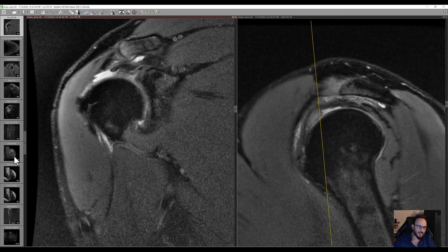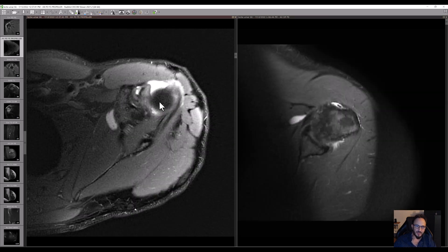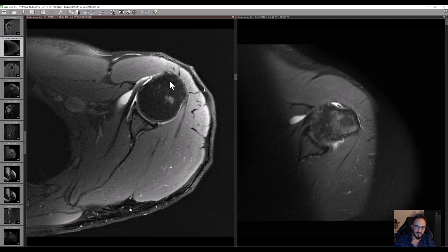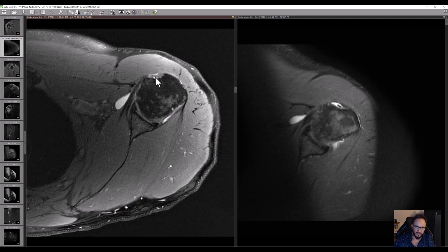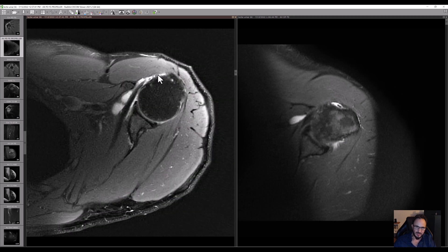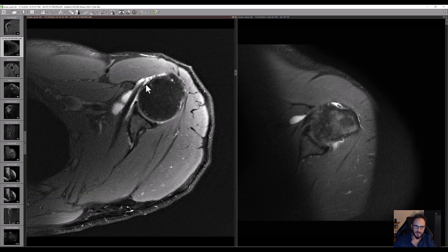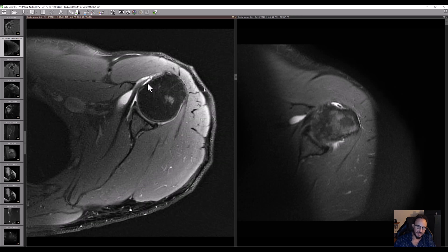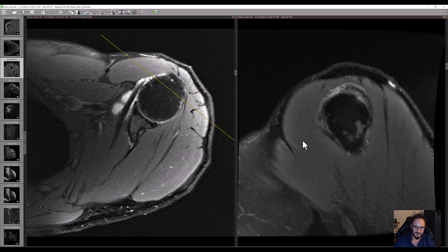We can also see this on axials. On the axial view you see the bicipital groove — no tendon. We go up and there is something wrong here. This is the subscapularis tendon, and the insertion of the subscapularis is not good. It is almost completely torn at this insertion.